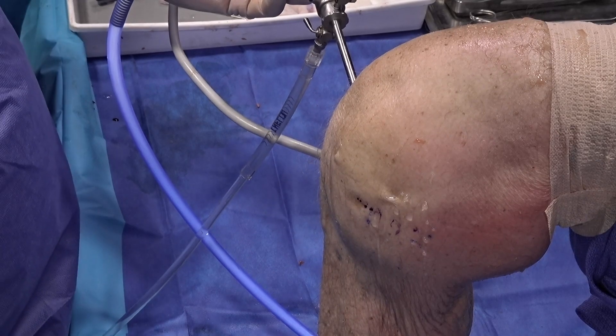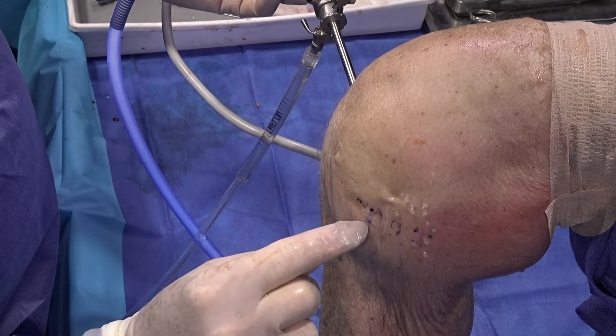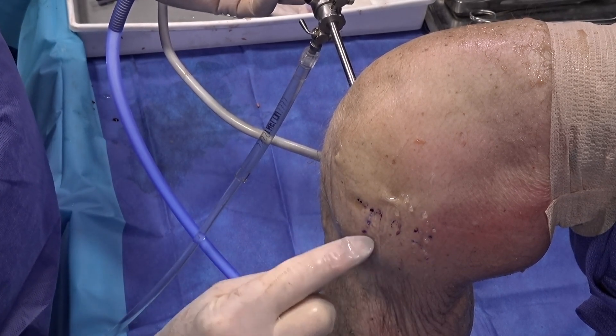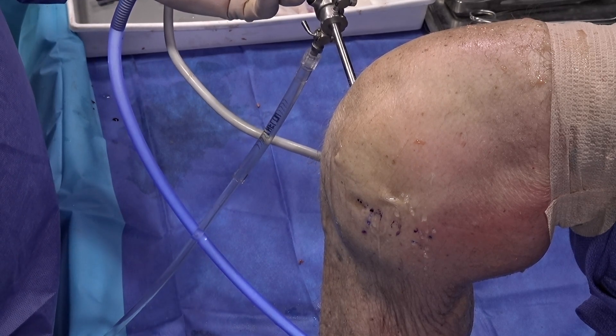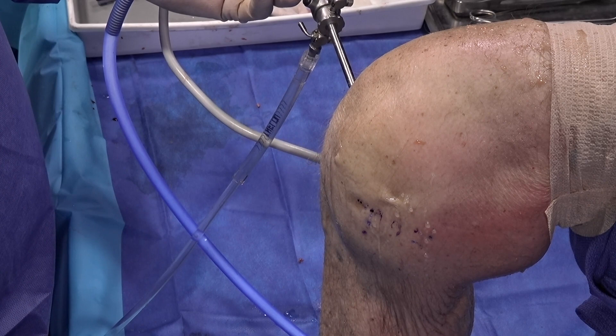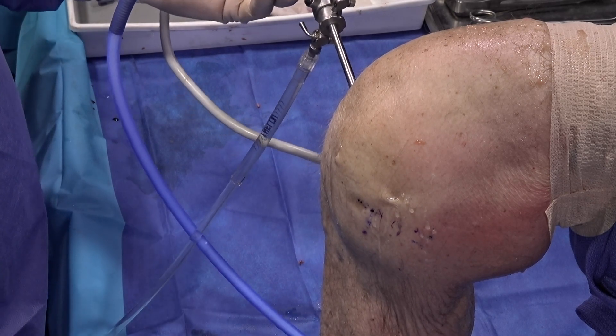Here on this specimen, we've marked the joint line and the anterior and posterior extents of the medial meniscotibial ligament insufficiency. That is done preoperatively in the operating room via ultrasound, and those marks will serve as important landmarks for the steps of this procedure.